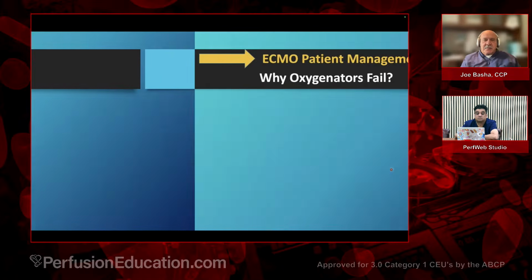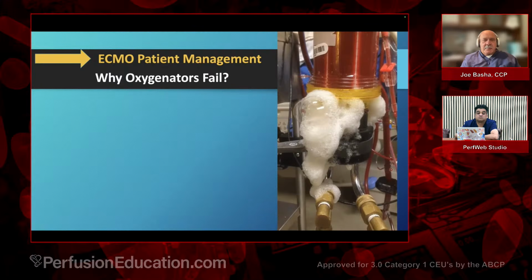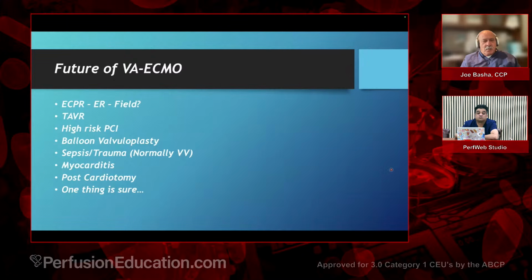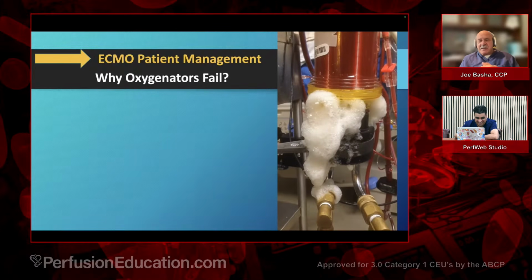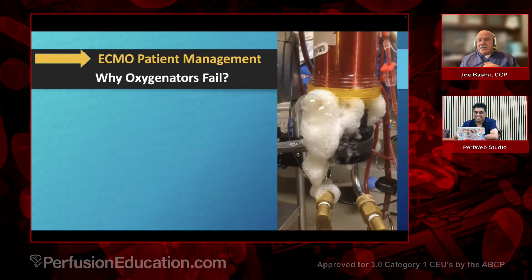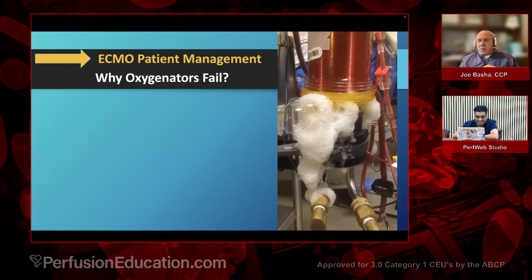And one thing is for sure... I'm not sure what one thing is for sure, but let me show you some slides of oxygenators that fail. Here's a video. I think you can see it. You can't hear it, but that is a polypropylene fiber oxygenator.